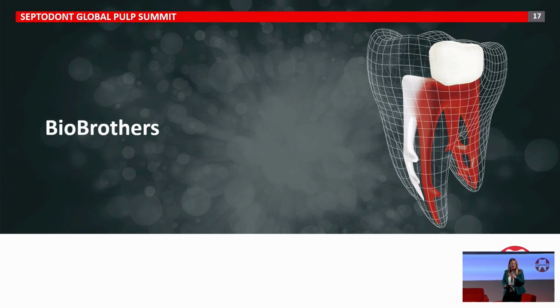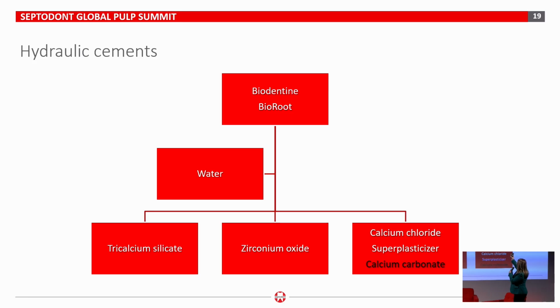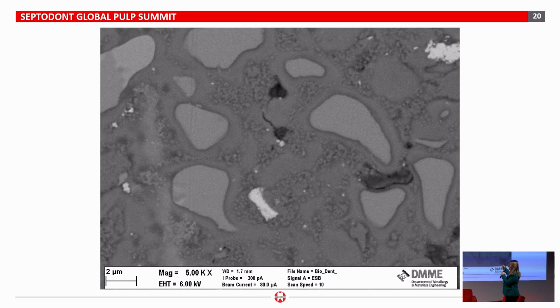Now it is very easy to explain the Bio Brothers. So, presentation, the Bio Brothers are, to me, the first generation of these material types, which is the Biodentine and the BioRoot RCS. So both Biodentine and BioRoot RCS are mixed with water. They are tricalcium silicates, pure tricalcium silicates. They have zirconium oxide and some additives. You see, if you subdivide that, it is very, very easy to understand why materials behave in the same way. My best image of a lifetime, very, very nice image of the official photographer.